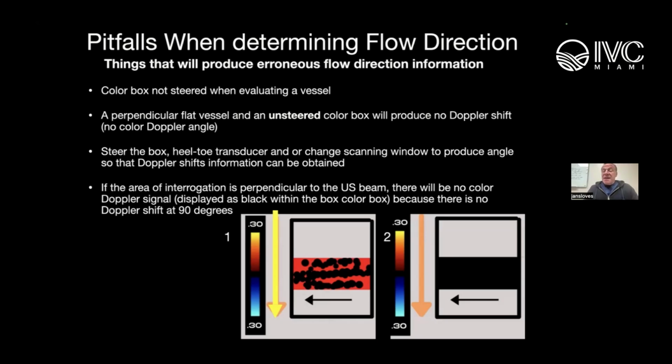It really is. Exactly. And we're going to talk a little bit about pulse Doppler a little further out. Interestingly enough, the ultrasound manufacturers have come up with some ways, from an engineering perspective, to further steer the box. Some of these companies refer to it as intelligent steering. As I'm showing in these schematics, you're either to the right, to the left, or straight on.